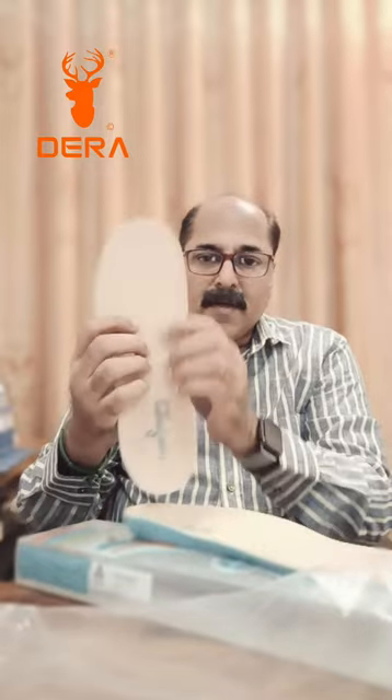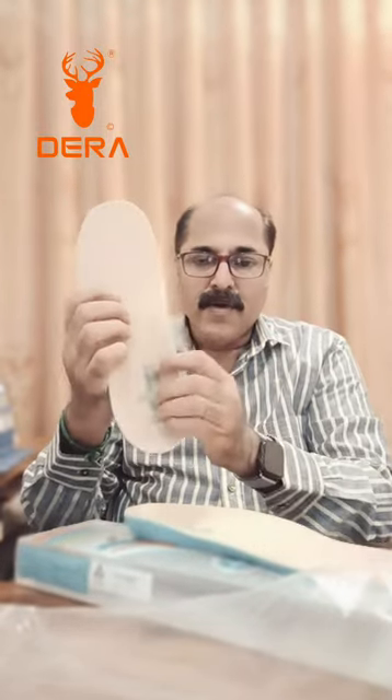This is available in extra small, medium, large, and other sizes. On the top there is a Plastozote layer and an anti-bacterial layer. The bottom is PU.